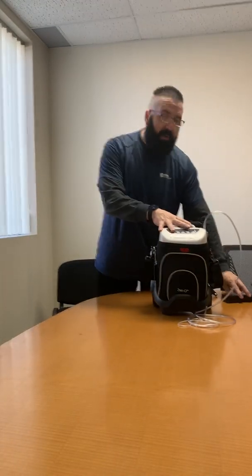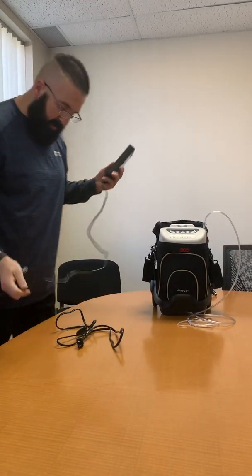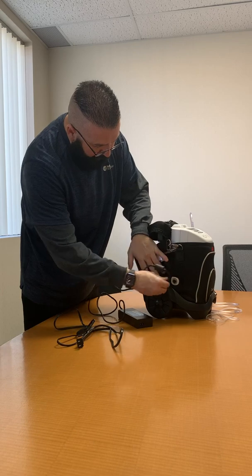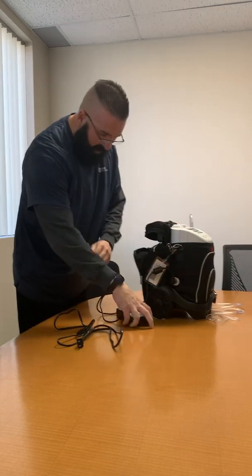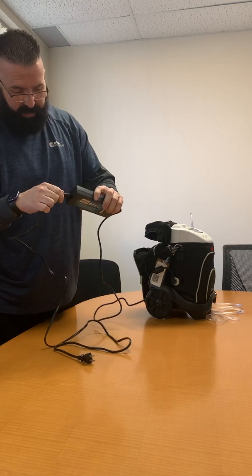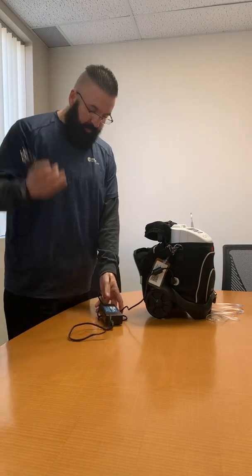We've got two different ways for this unit to be used. So we have the regular wall powered AC, and you've got this end that connects up to the side over here. Now I also want to point out that there are two pieces to this, okay? So there's the piece that plugs into there, this plugs into the power brick, and then this would go directly into the wall socket.